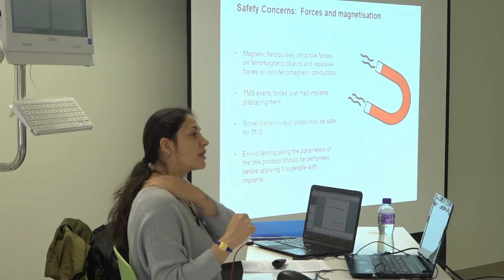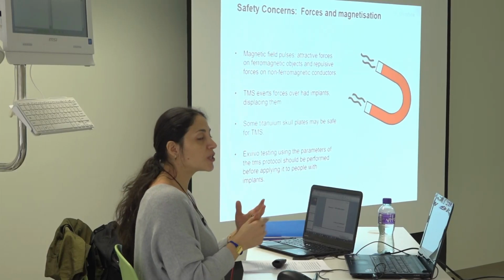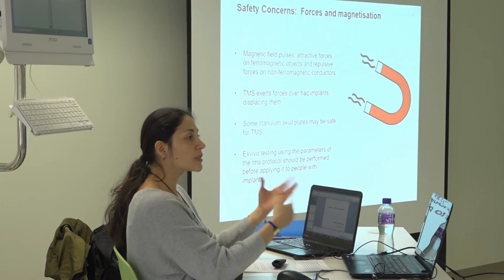So I really recommend that, because it will take a burden off your back when you have someone to consult about what is appropriate and what not. You will have situations where people come with certain conditions that you don't know, that are not on the list of things you should not follow, and you don't know how to answer. Same thing when you have people that have some implants: you do the ex vivo testing, check how it works, and then report the results too.